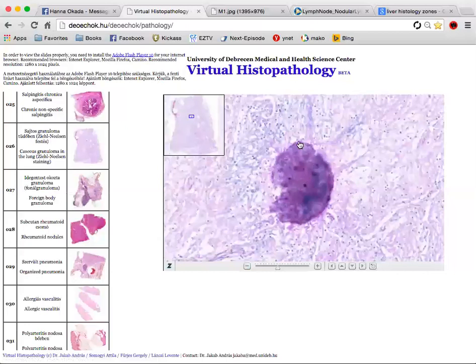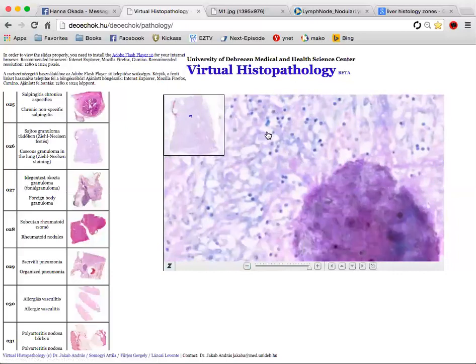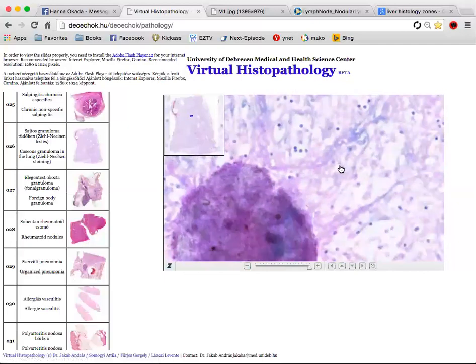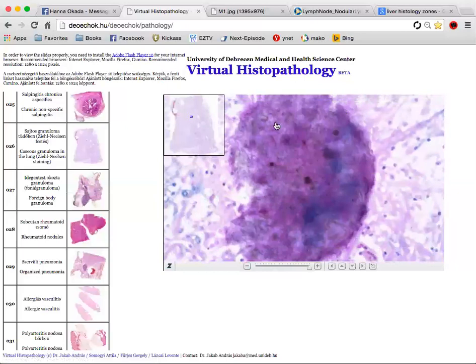Okay. So this is a granuloma, and basically it holds bacteria inside, and on the outside you see all these elongated epithelioid cells that are the macrophages. Here in the periphery, all these blue dots, these are probably all some T lymphocytes and maybe some macrophages on the outside. Okay. And this is the area of the granuloma, and all this blue, that's calcification.